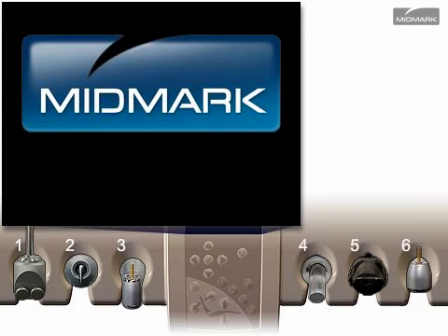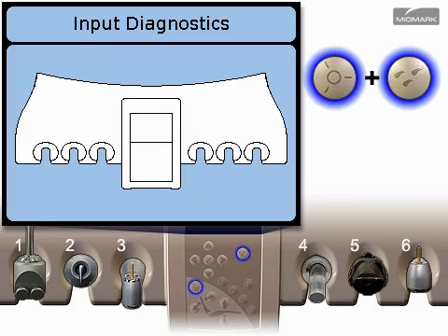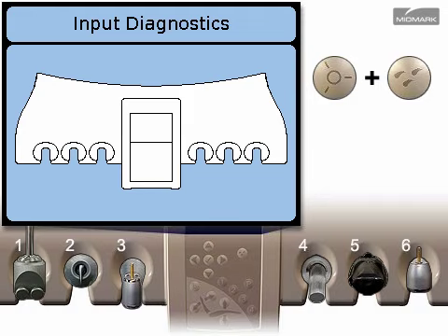Control and display diagnostics. Press the light and water buttons at the same time to access the input diagnostic screen.